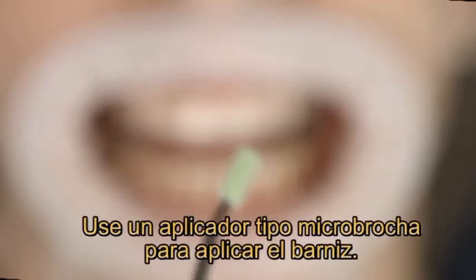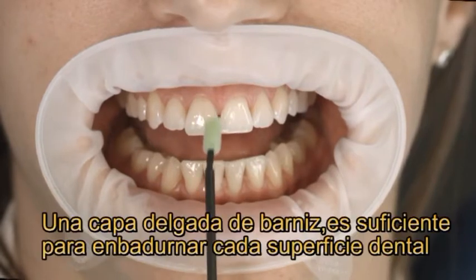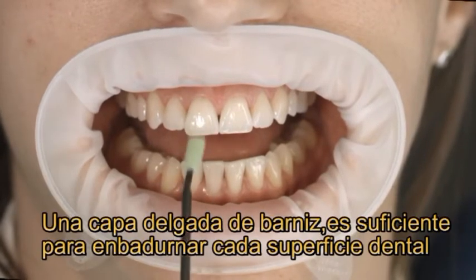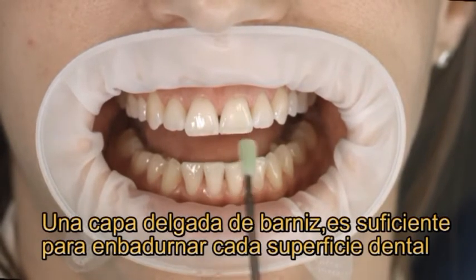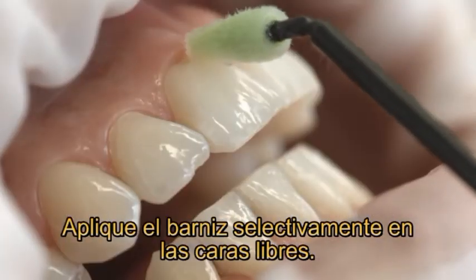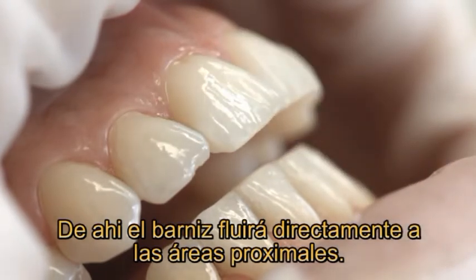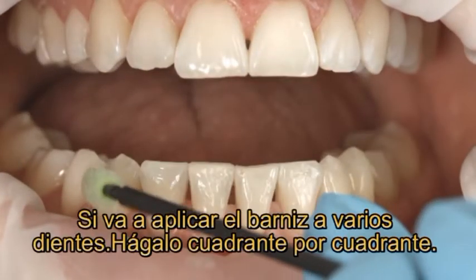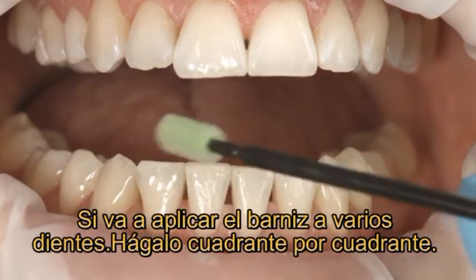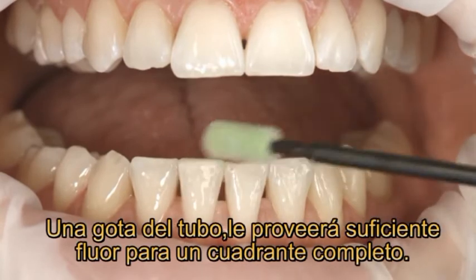Use a VivaBrush G applicator to apply the varnish. A thin layer of varnish is sufficient to provide the teeth with an optimum amount of fluoride. Apply the liquid varnish selectively to risk sites; from there, the varnish flows directly into the proximal areas. If you apply the varnish on many teeth, do one quadrant after the other. A drop from the tube will give you sufficient varnish for one quadrant.